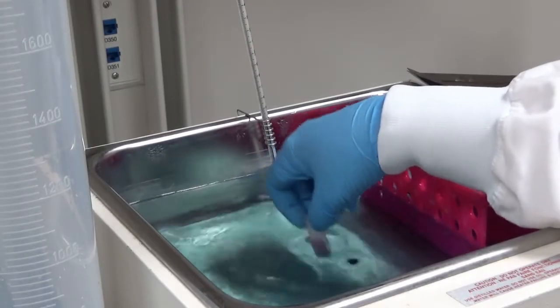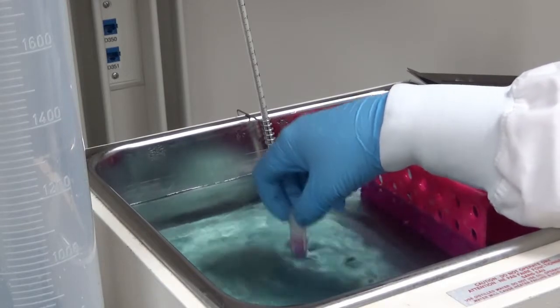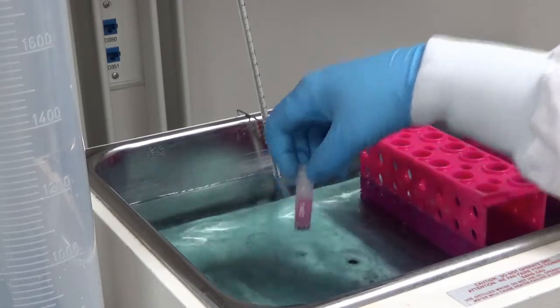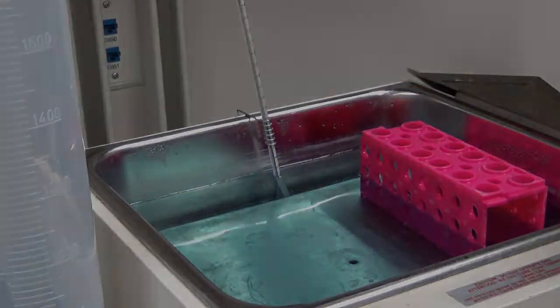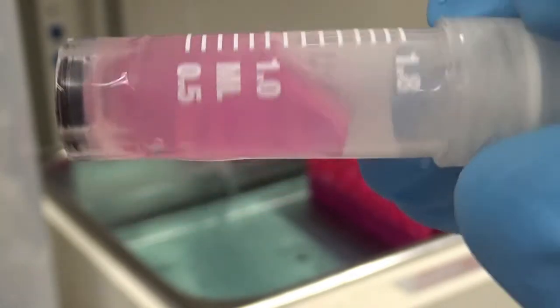Swirl the tube in a 37-degree water bath to melt the freezing media, approximately 1 to 1.5 minutes. Keep the cap of the tube above the water level to avoid contamination. Swirl the tube until a small ice crystal remains.